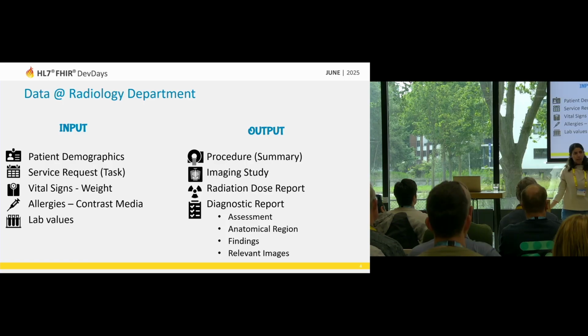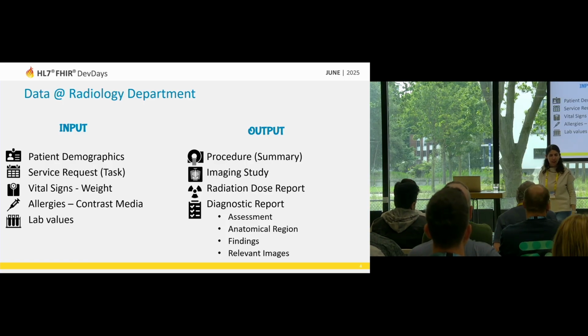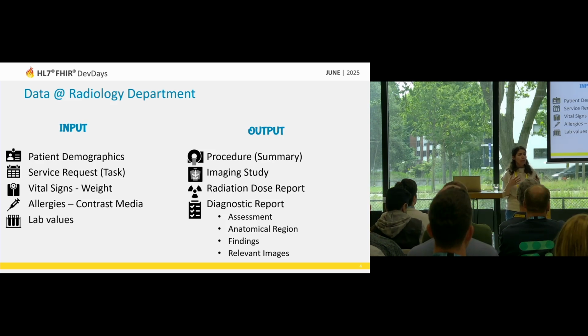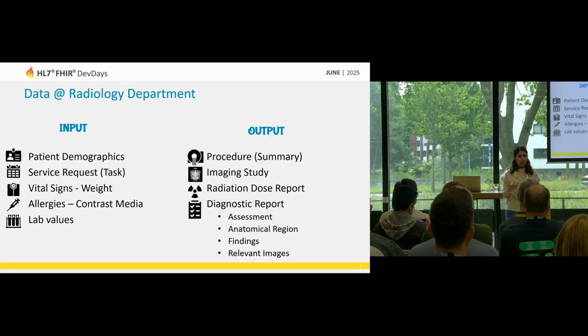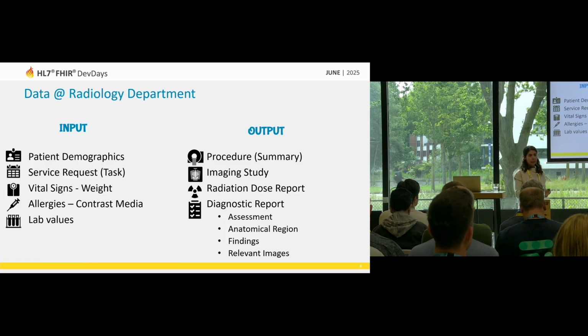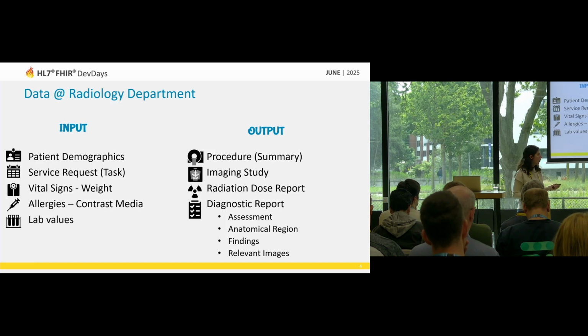Of course, there is an imaging study. Everybody knows that. You go there, you get scanned, you get some images. Additionally, when a modality or scanner involving radiation is used, in many countries there are regulations that you need to report how much radiation dose has been provided to the patient. And furthermore, of course, you have the diagnostic report. In the diagnostic report, you have the overall assessment: does the patient need special treatment or a follow-up? And where were the findings? And of course, the relevant images.